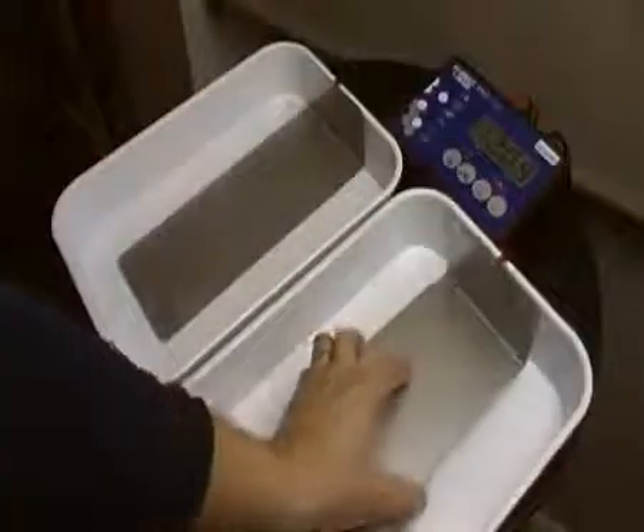Setting the machine up is really simple. Here we've got some standard treatment trays that we supply on our website. We've got the control panel, the power leads, the colour-coded electrode cables and the electrodes that you use for hands and feet treatments. If you don't have these, you can just use the carry case — they double as treatment trays anyway.